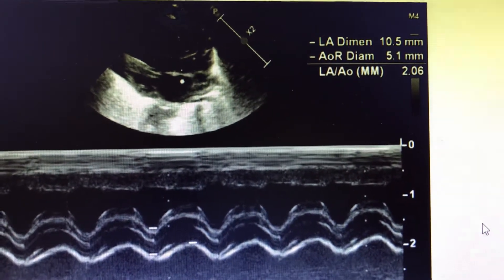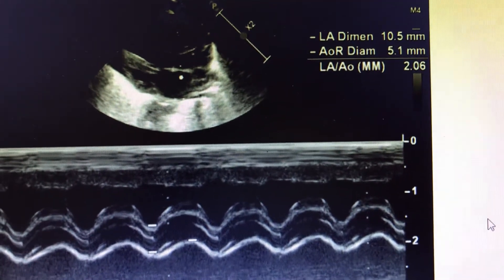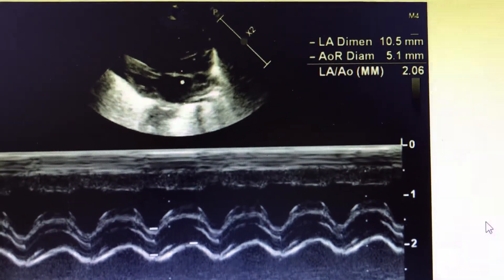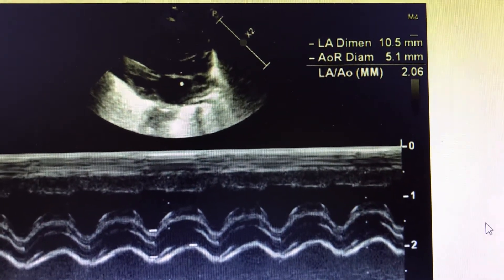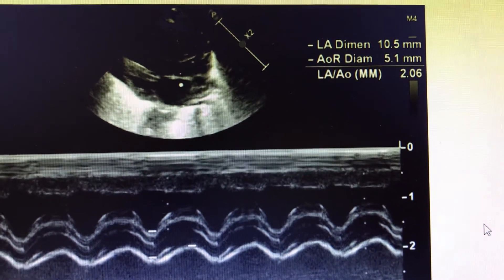Another marker is the descending aortic blood flow, which we will be discussing further. So LA dilatation is one of the markers of a large PDA.